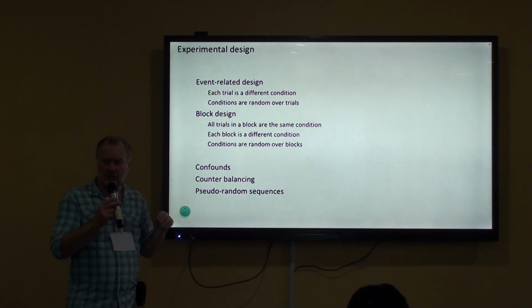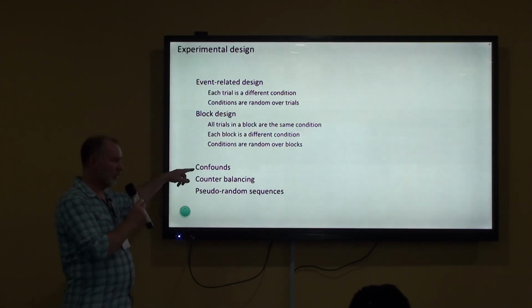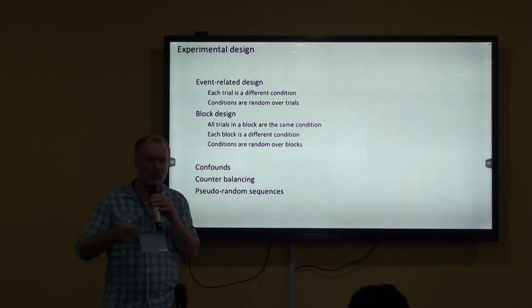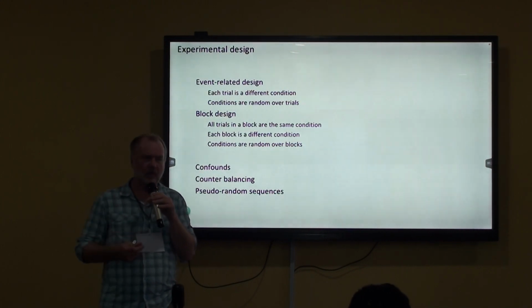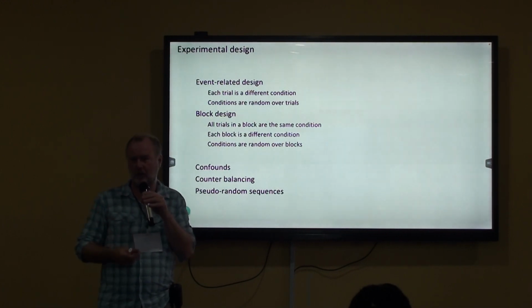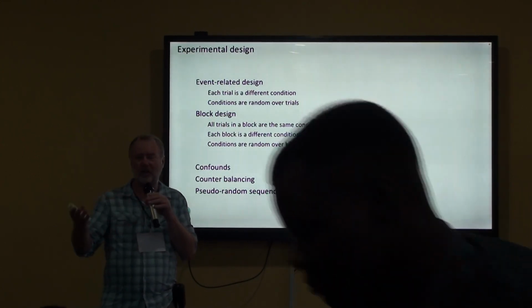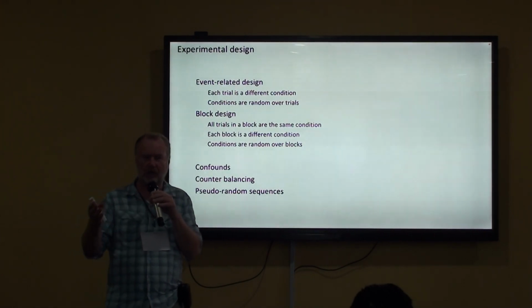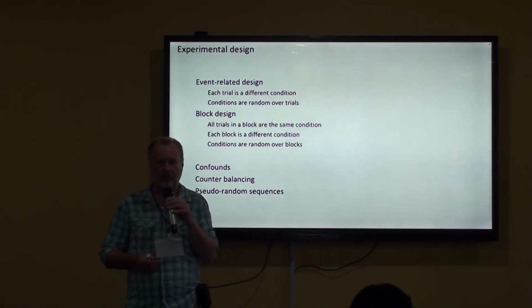The reason for random shuffling being important is that we have confounds. If you always present stimulus A first and then stimulus B, or if you present block A first and then block B, then during block B, the participant has been sitting in the EEG lab longer, and perhaps the participant is fatigued, is bored, doesn't want to do the task anymore, and then systematically the cortical processing in task B would be different than the cortical processing in task A.